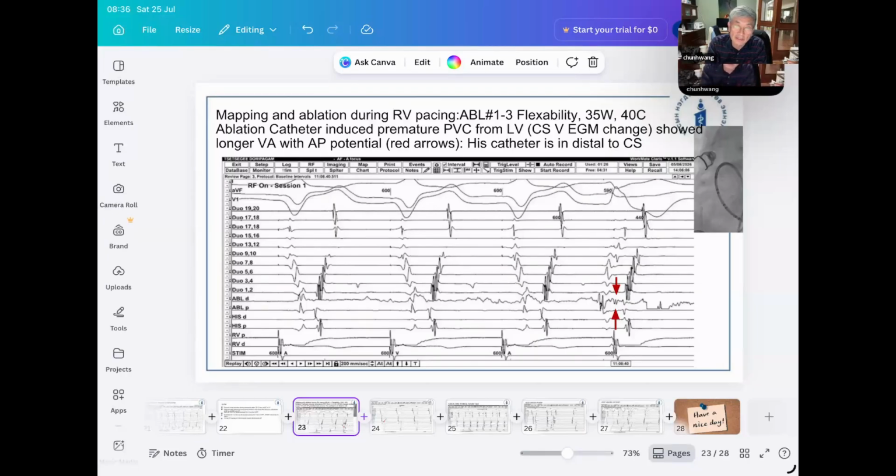So that's the epidemiologic finding. The second important finding is that if this were a PJRT, this patient probably would have been ablated a long time ago because it's very symptomatic, or she would have been taking medication all the time. Now, what other explanation do we have for a decremental conducting pathway? I think we discussed this before.